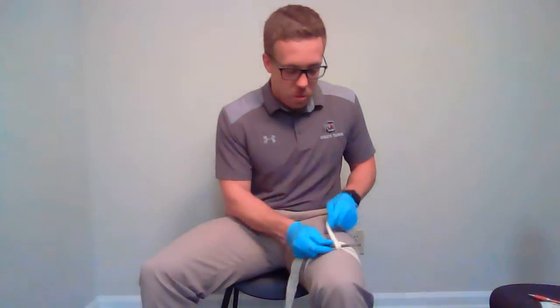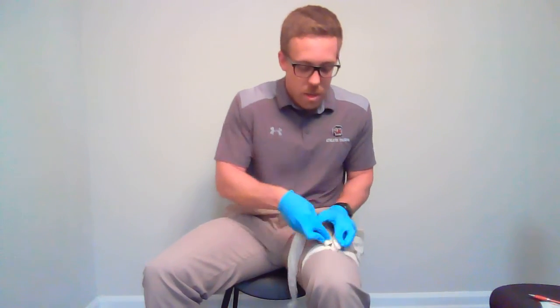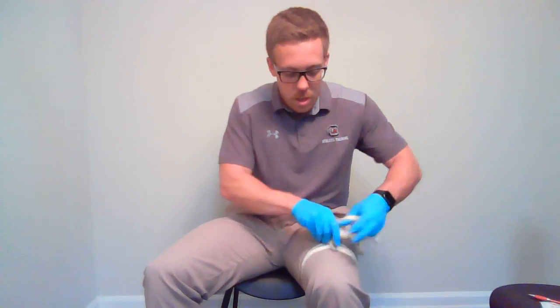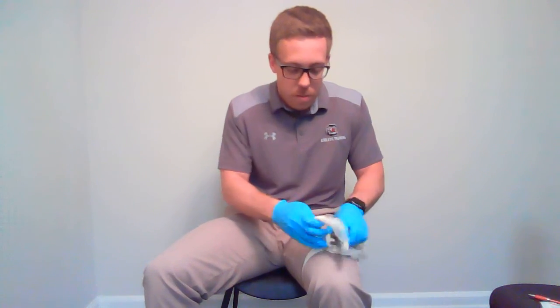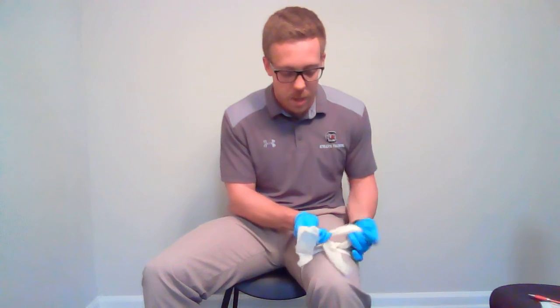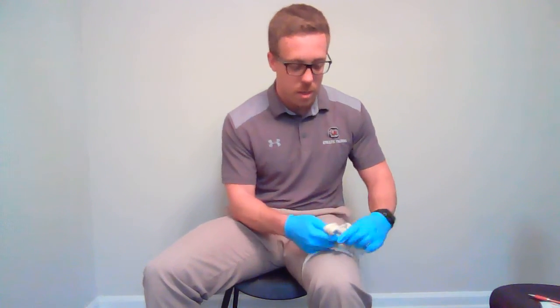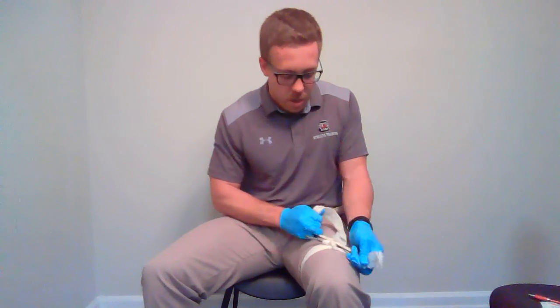After that, grab a pen that you should have in your kit. Wrap the bandage around it once, then a second time, and start twisting. As soon as you start twisting it should get very tight. Once you complete that, tie another single overhand knot to secure it so it won't pull loose.